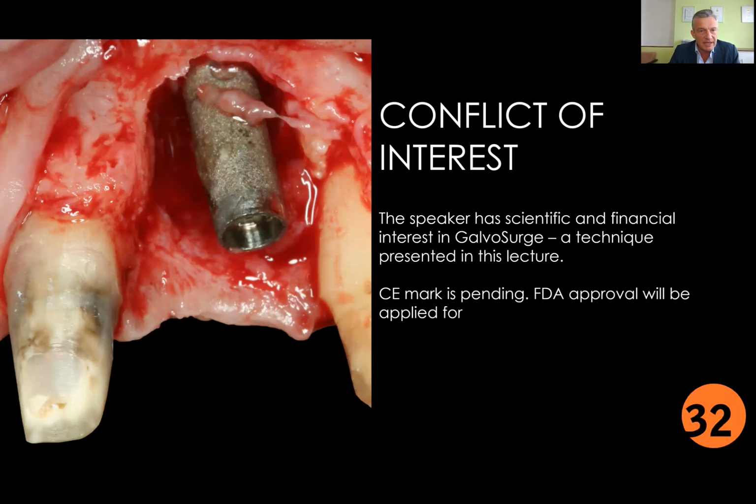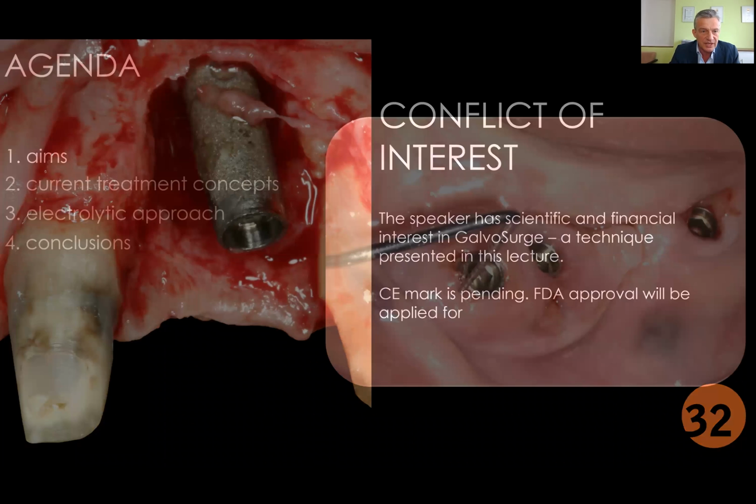Bad implant axis, position, tartar, inadequate soft tissue management, and other faults a dentist can cause may initiate this disease. But finally, we have to clean the implant before we treat it, and we need to decide which implants can be retained or which implants have to be removed. This will be the aim of this presentation.